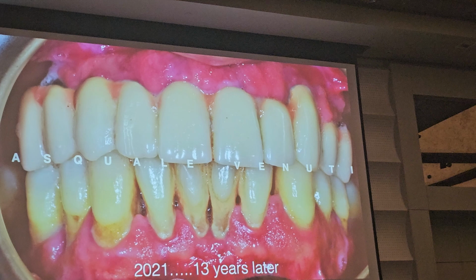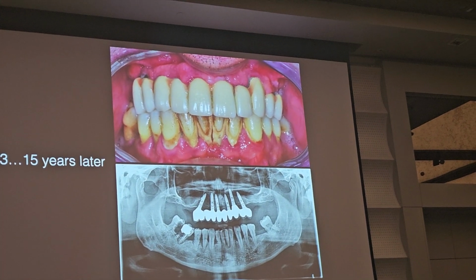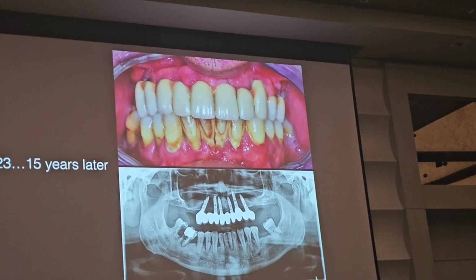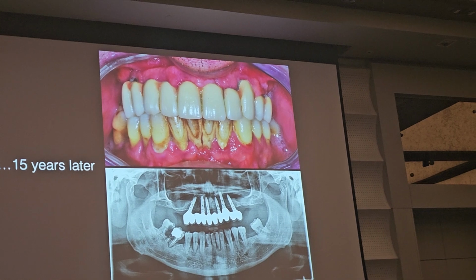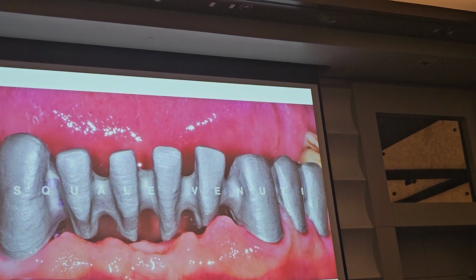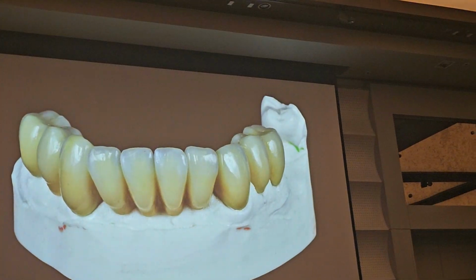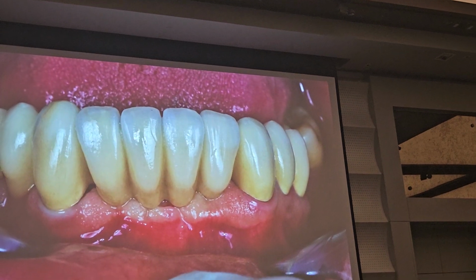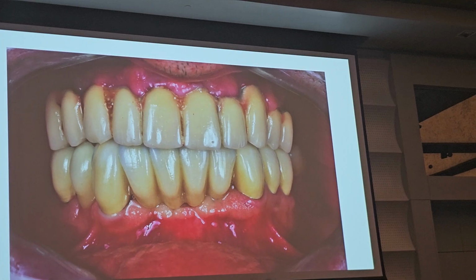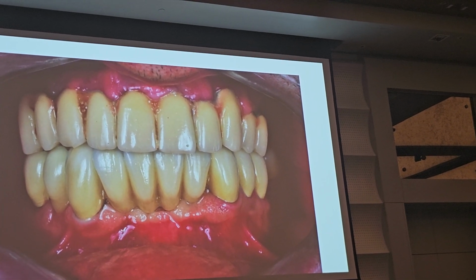So the lower arch starts to fail. So I decided to extract the incisors and do a bridge on the remaining dentition. Maybe we can go on for another five, six years. So vertical prep, metal framework, do not mess up, metal ceramic. But then, patient called me after six months, he had a click. The ceramic is gone, okay.